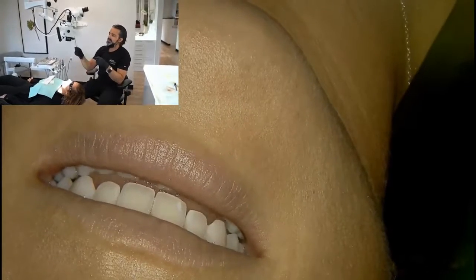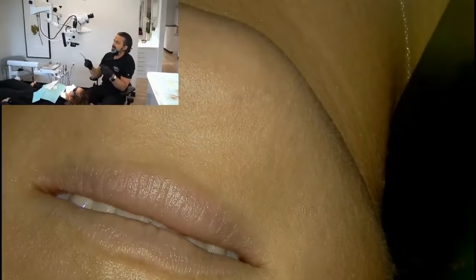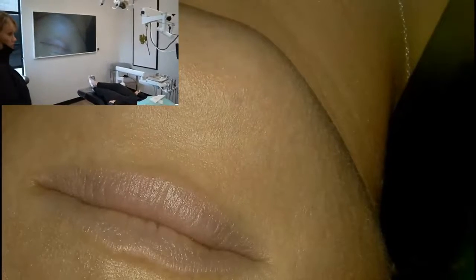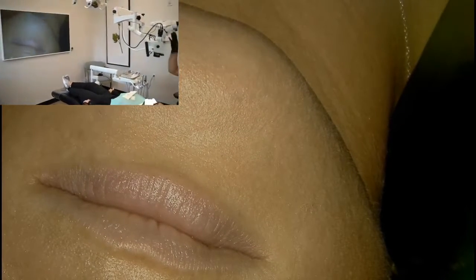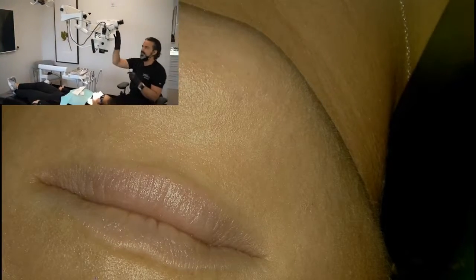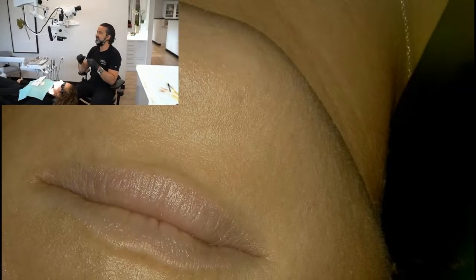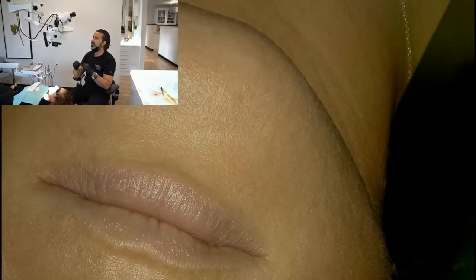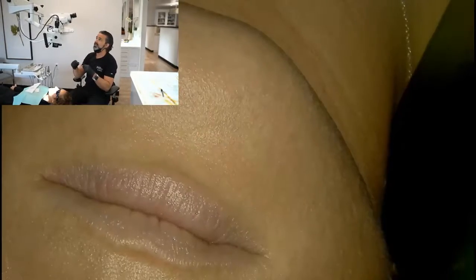The other thing is, we're not really practicing right now, but there will be lens caps you can put on for splatter for your lens, or a bag that you can put over your microscope so you're not constantly wiping this down when you touch it, especially if you're doing surgery with bloody hands. That's something you'll have to address by cleaning the underside of that lens early and often.